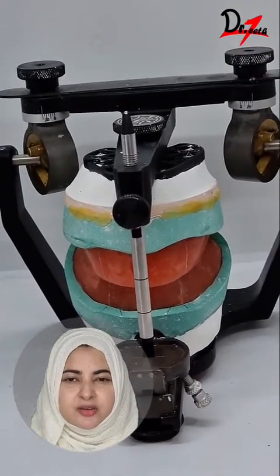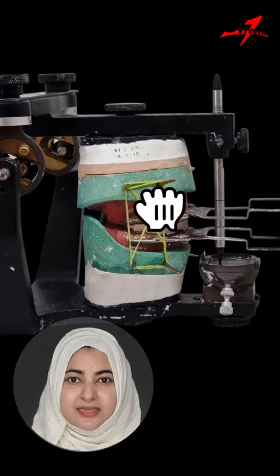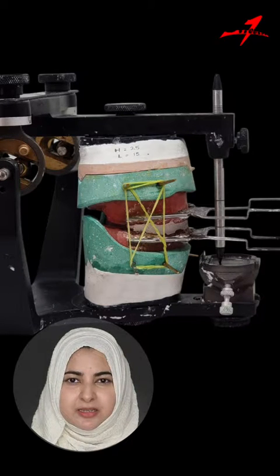After tentative jaw record, tracers are attached to the rims and centric and protrusive records are made. The maxillary cast is detached from the split and the centric record is placed in between the assembly. Then the upper member of the articulator is closed.